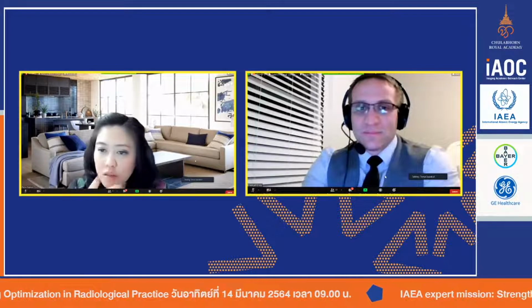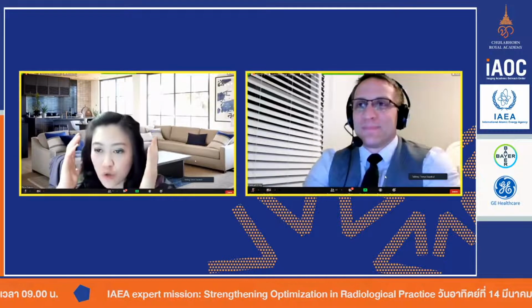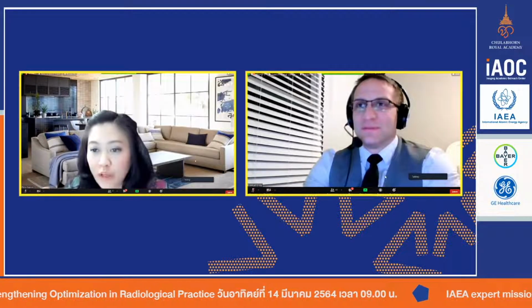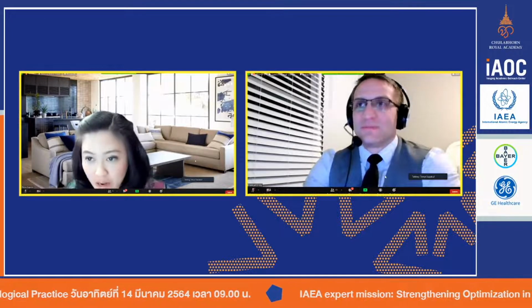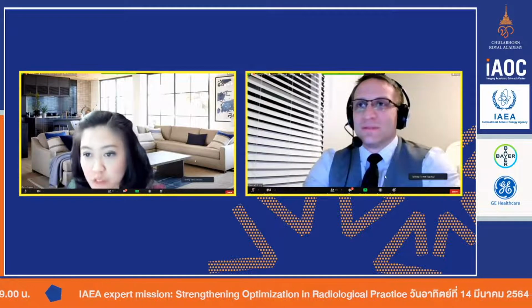So let me rephrase that. The radiation dose depends on the coverage that you do. Yep. But when you acquire the image, it covers everything in the body that you need. So let's say you want to get a CT of the thoracic spine. When you acquire the images, you're going to include the chest and thoracic spine, but you need to make the images for the radiologist. That's why you need a smaller display field of view to zoom in on the image of the thoracic spine and apply the filter and those things, right?